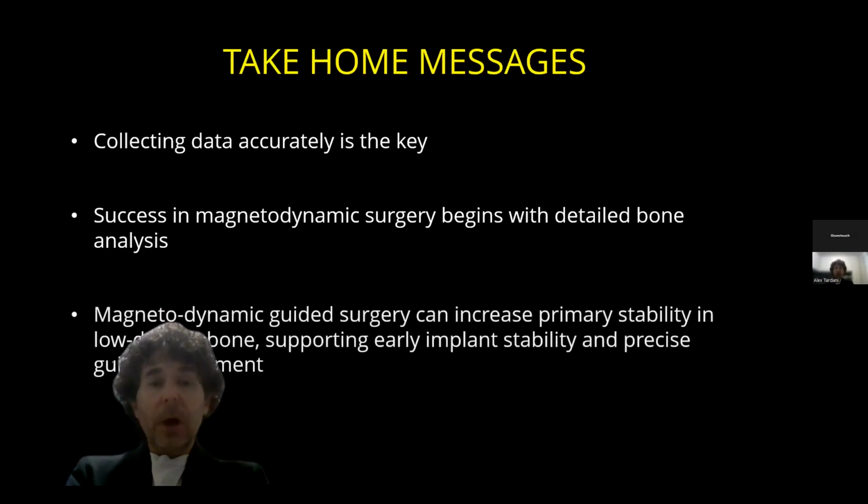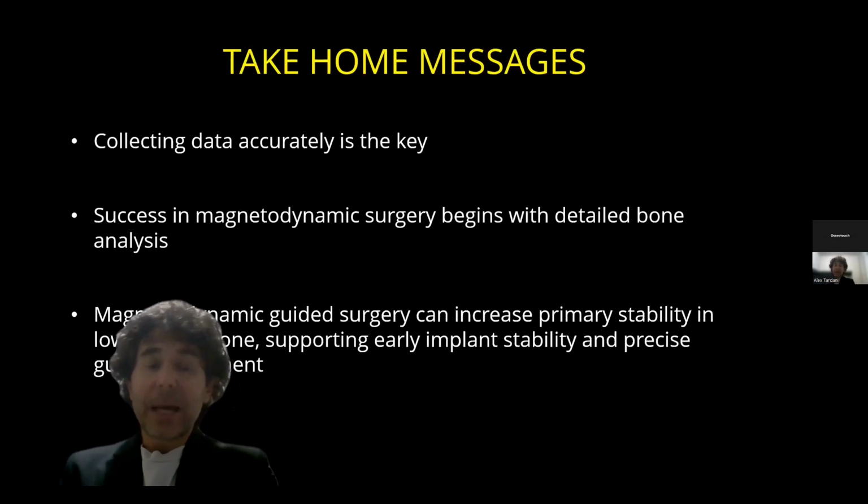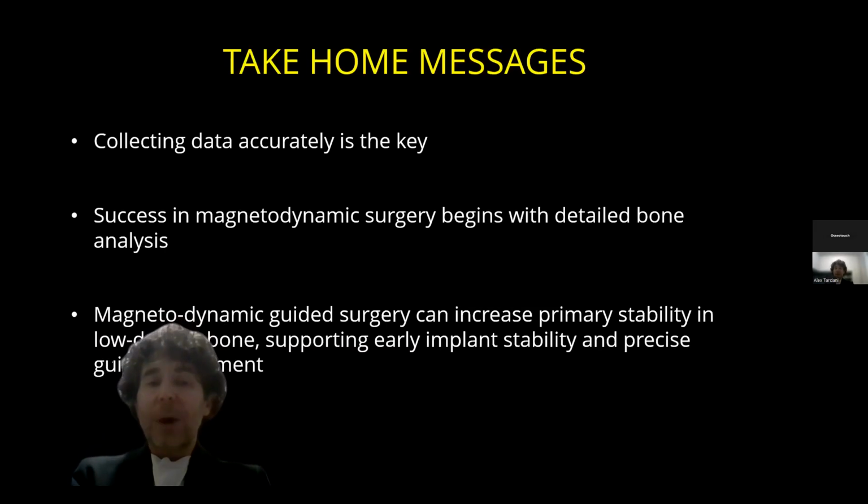Last but not least, what are the great advantages of magnetodynamics, and why do we like it? Because above all, I personally like it a lot for its use in extraction sockets, where I use it in almost 99% of cases. It guarantees that in almost 100% of cases, I can achieve a primary stability in low-quality bone, and where there's little bone, because clearly, after a tooth extraction, the percentage of cases where we already have residual bone sufficient to place an implant with drilling alone is very limited.